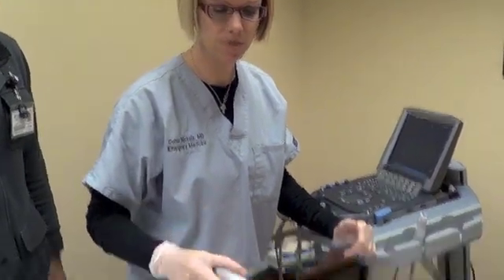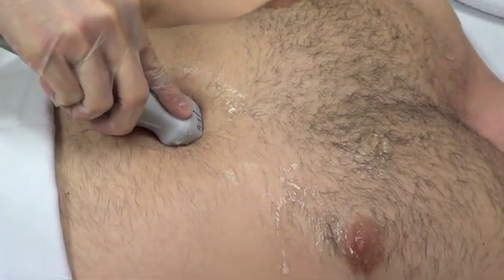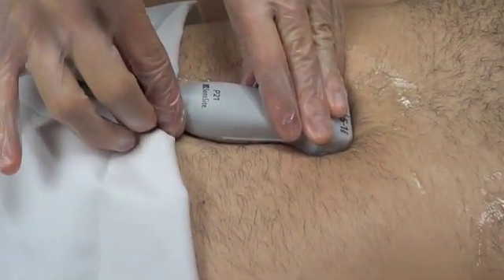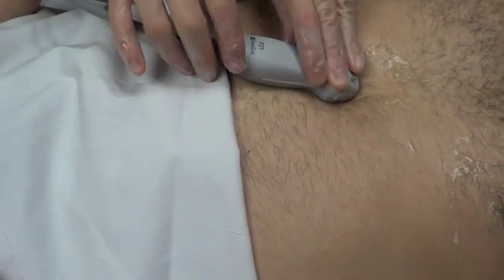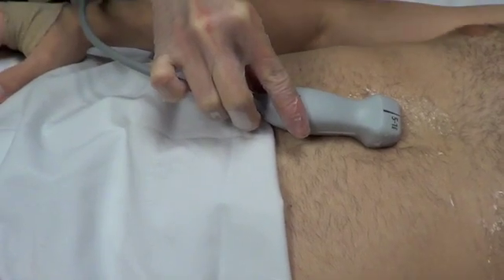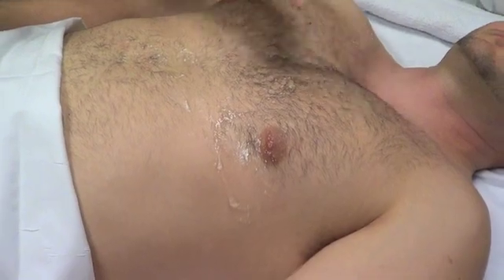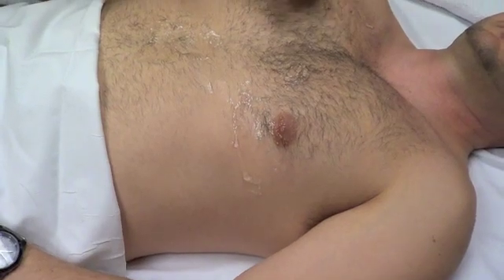For sub-xiphoid in obese patients with a protuberant abdomen, have them take a deep breath — you can also press your probe down firmly. Taking a deep breath brings the heart down towards your probe, making it easier to get the view. The same applies to COPD patients and generally for parasternal long axis. If the patient's had a left lung resection, the heart may be shifted more to the left; with a right lung resection, more to the right. So you may have to adjust your probe placement accordingly.